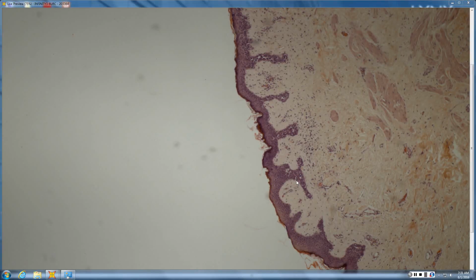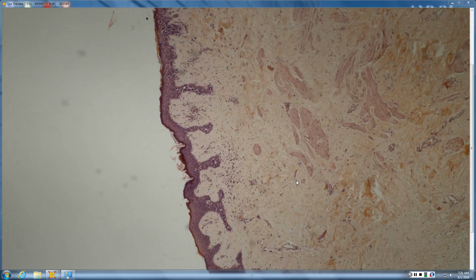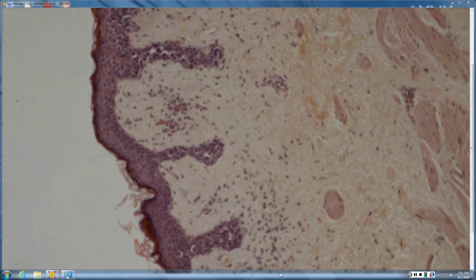So, good morning, everyone. And for those joining us remotely, we are doing the second session of epithelial tumors, so focusing on the malignant epithelial tumors. So, it's Tiffany, right? Yes, sir. Okay. Do you want to start out?